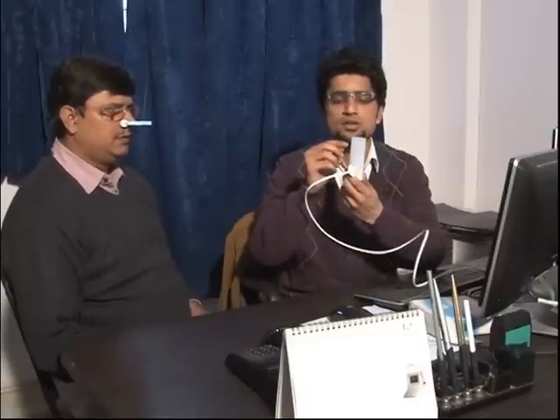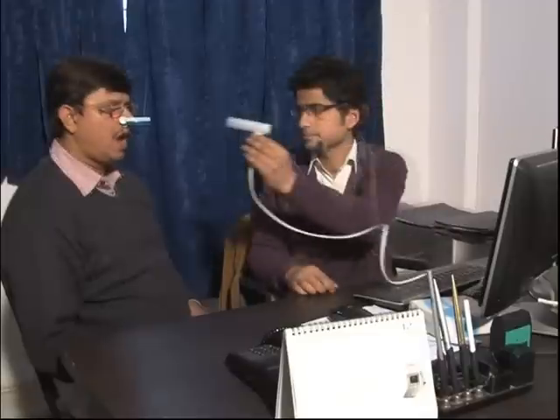Now this transducer is inserted in his mouth and is advised to be inserted to the third mark on the transducer.